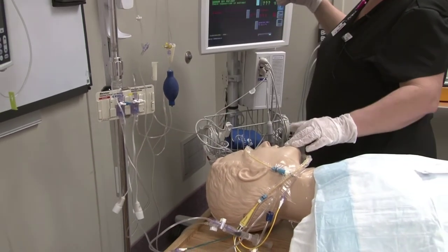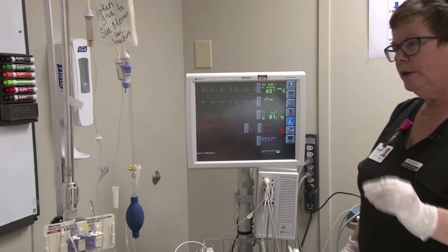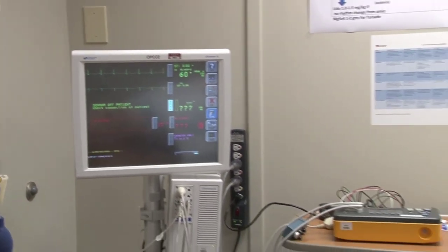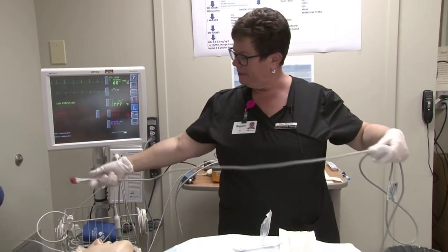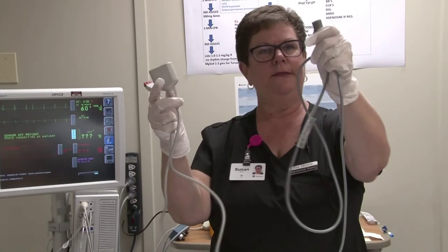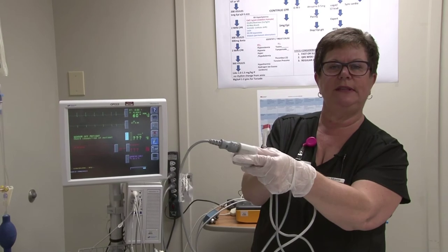Up on the monitor you have nothing except your ECG. In order to display waveforms you need two cables. You will have this connector that goes into the Spacelabs monitor and two long gray cables; one end friction-fits into the cable and the other friction-fits into the red area of the monitor, just like setting up an art line.